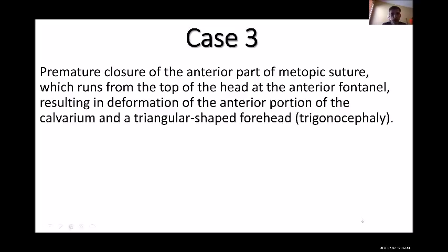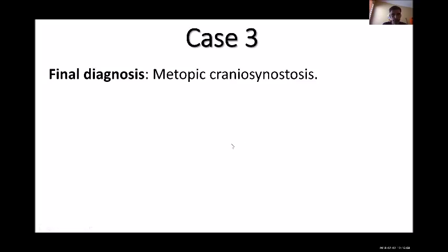Yes, Uthman, you typed it very well. Well, you missed some letters, but it's okay. So remember, when you go to the exam, make sure that your spelling is correct. So it's craniosynostosis, and look at the spelling. Whoever texts me, that is the correct spelling.